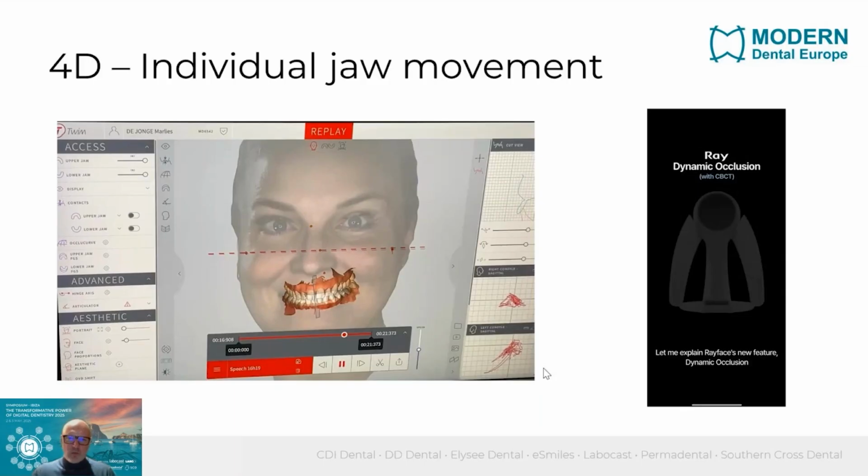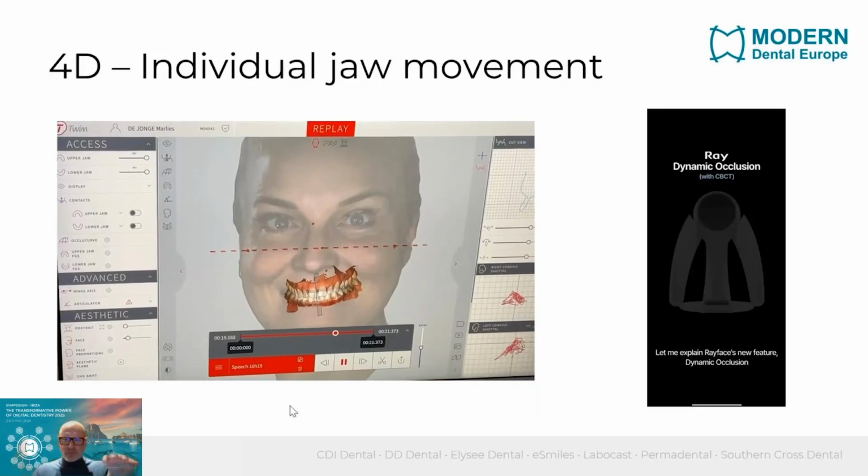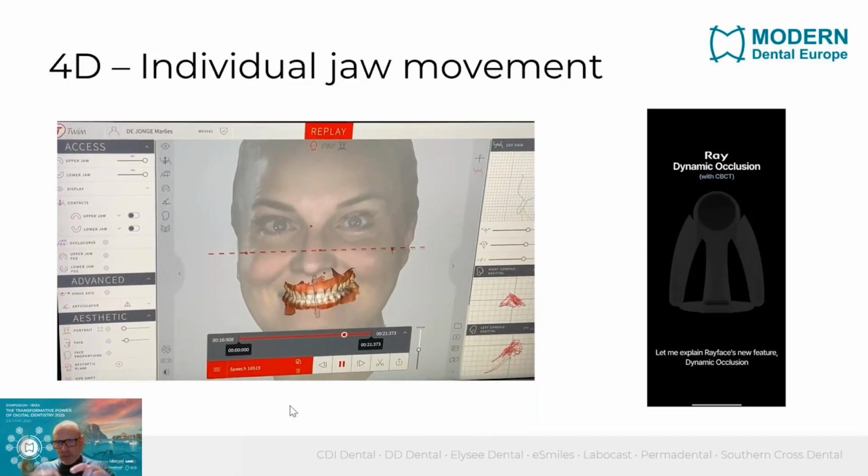So how does it work? It just uses, I will play the video again, optical tracking to really record the dynamic jaw movements. You see also from both condyli the envelope of movement, and there you can also compare left and right condyles to see if you have maybe disorders which should be addressed in the treatment or during the production or fabrication of, for instance, a denture, an All-on-X work to prevent premature contacts and chipping, etc. So very interesting.